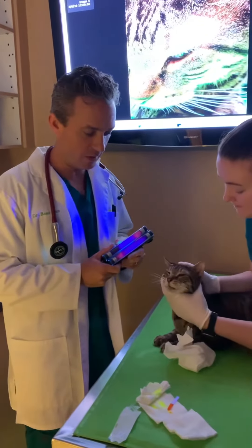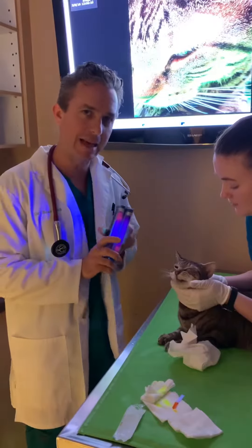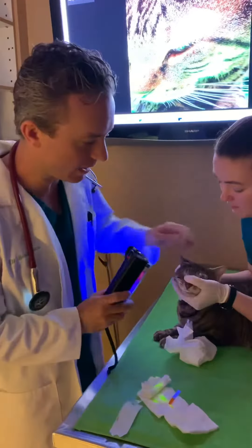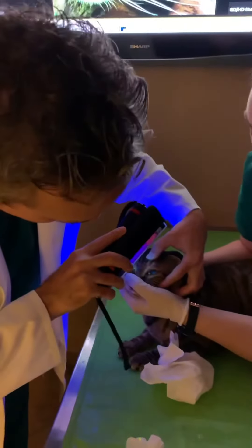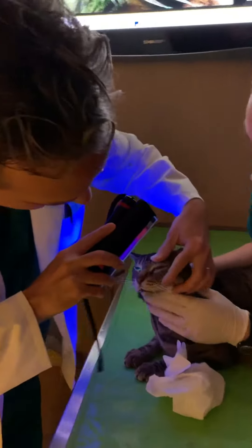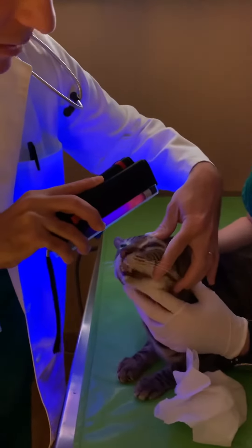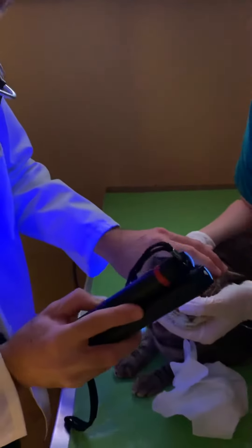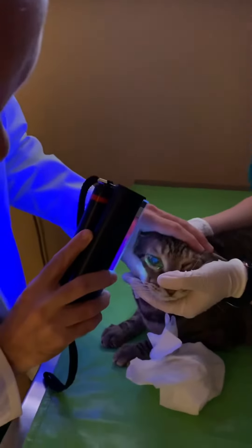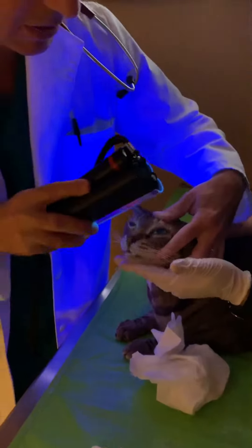Now what we're going to use is a woods lamp. This is a light that's going to help us pick up anything abnormal on the surface of the eye. You can see that the eye does glow a bit, but what we're looking for is anything that glows yellow on the surface. The cornea is made up of layers, kind of like an onion, and if that superficial layer is injured, they can develop an ulcer which needs medicine.